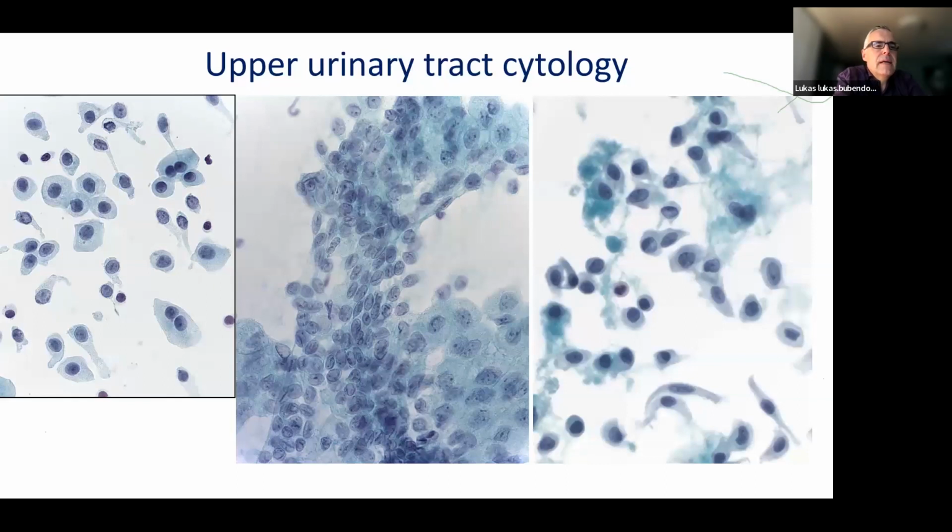Well, this illustrates practical examples. We are looking at 3 upper urinary tract washing specimens, and all patients were evaluated for the possibility of urothelial neoplasia. Now, you can make your own decision how you would call them. Of course, there is always a pre-diagnostic probability condition. If a patient had previous urothelial carcinoma and he's under control, there is by definition a higher risk of neoplasia. We don't talk about these clinical aspects here. And it's not of relevance.